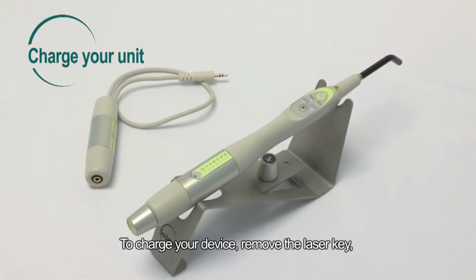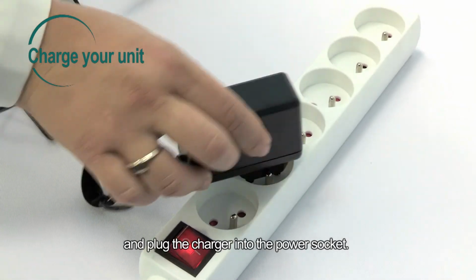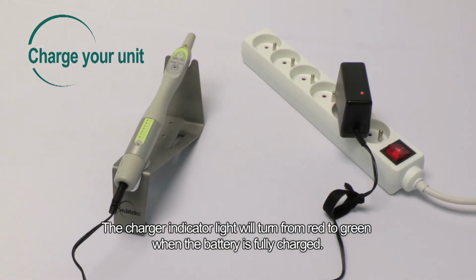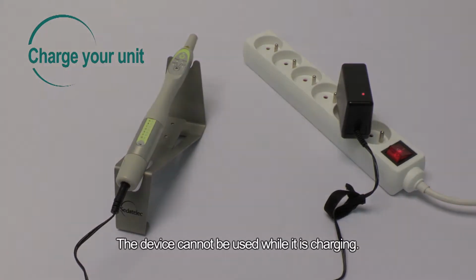To charge your device, remove the laser key. Insert the charger plug in the device and plug the charger into the power socket. The charger indicator light will turn from red to green when the battery is fully charged. Allow approximately 3 hours to completely charge the unit. The device cannot be used while it is charging.